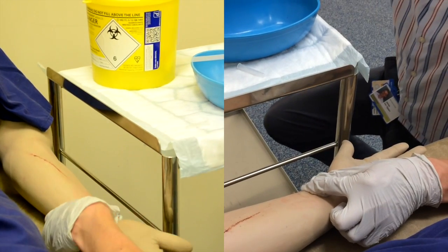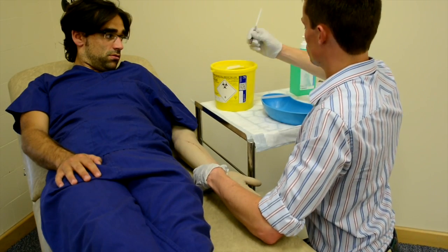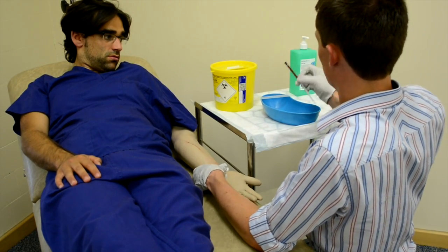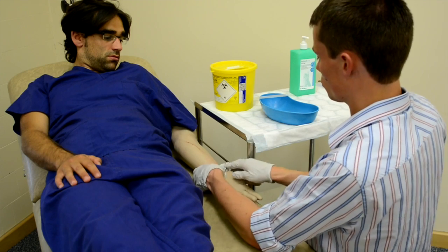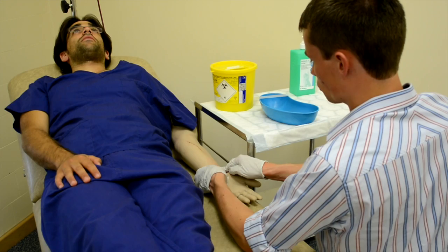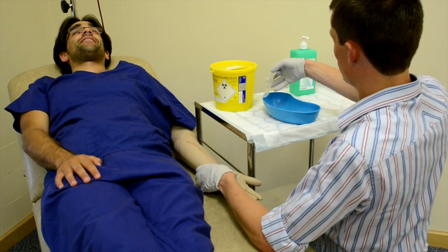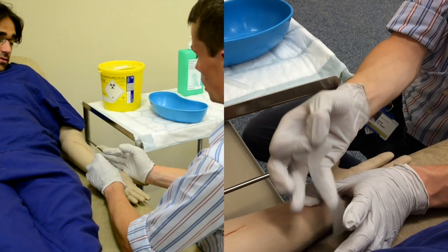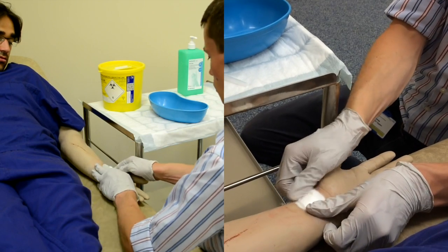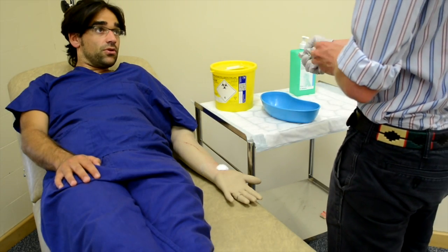Well done. I'm just going to be pushing quite hard on your wrist now for five minutes or so. You feeling all right? The bleeding stops, so I'll just put a small sticker over and then I'll leave you in peace. Thank you very much indeed. I'll get the results back to you as soon as we can. Thank you.